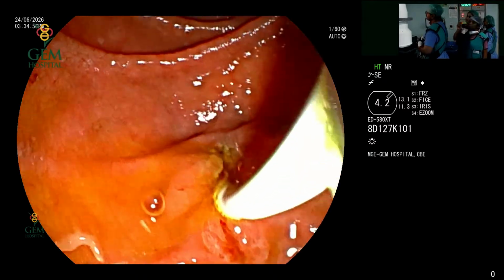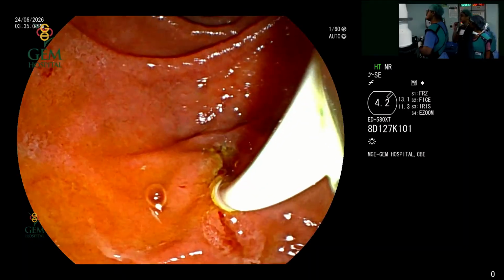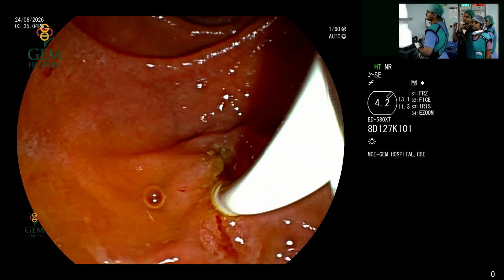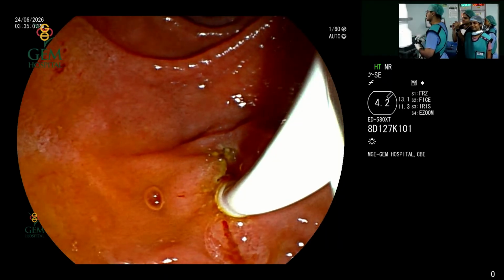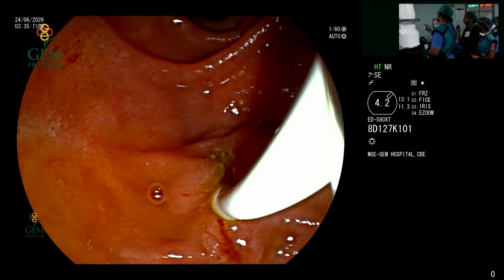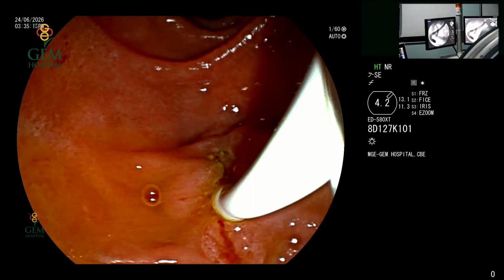We can see the clips in the cholangiogram image, which are actually put at the cystic duct, post cholecystectomy. The tortuous image that you see is suggestive of the cystic duct. We can see that even the cystic duct is mildly dilated. And this could be a reason where the stones could still be left over, the residual CBD stone.